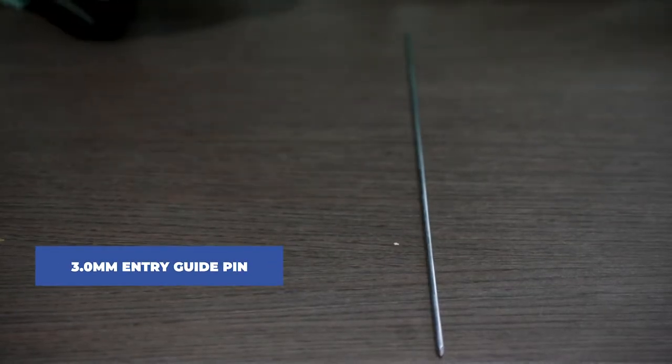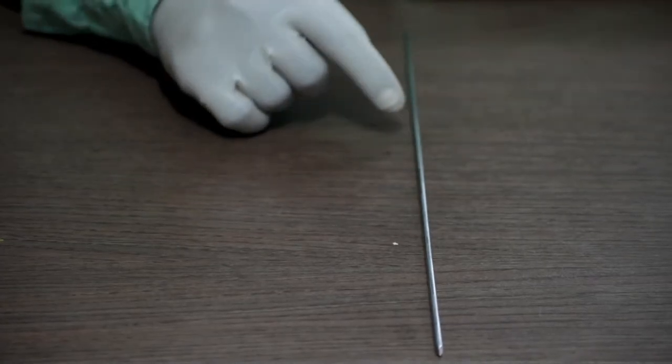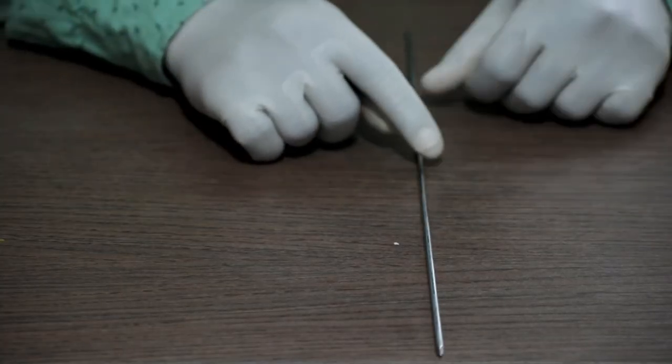Now let us check out the instruments. 3 mm entry guide pin. This is used to create the entry point. The diameter is 3 mm and length is 390 mm.